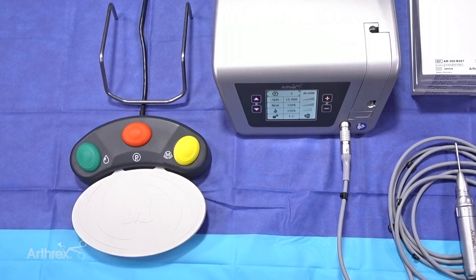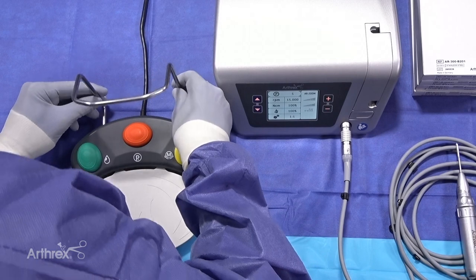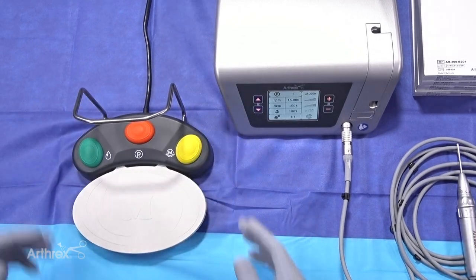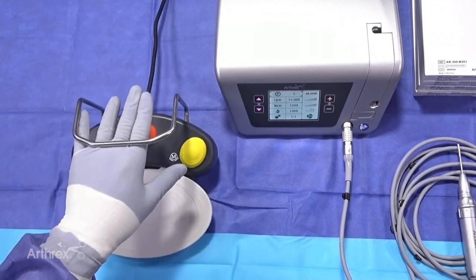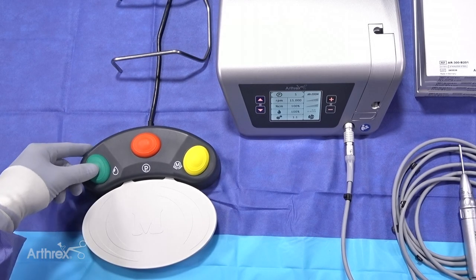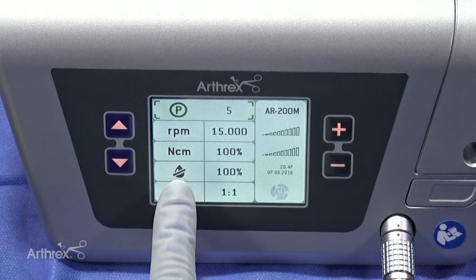Now we'll walk through the functionality of the AR200 foot pedal. It's important to note that this system comes with a bracket that attaches to the back of the foot pedal, allowing the surgeon to move the foot pedal seamlessly during a case. It has a very nice tactile feel, and with their foot they can simply pick it up and move it as needed. The left button on top of the foot pedal controls turning the flow rate on and off. When I push the green button, the indicator shows flow is on; push it again, flow is off.